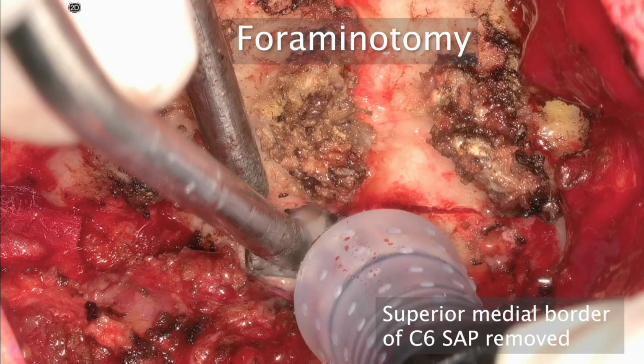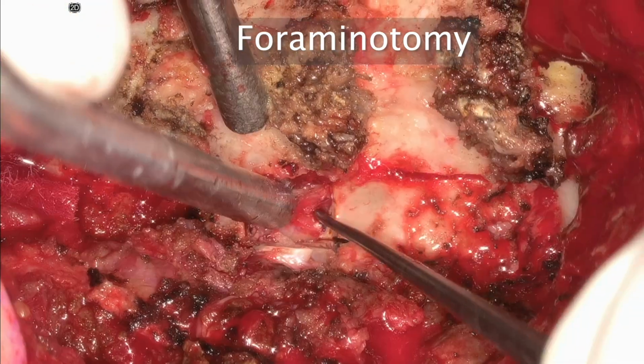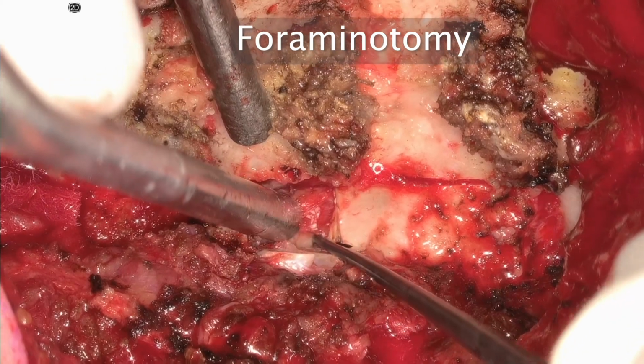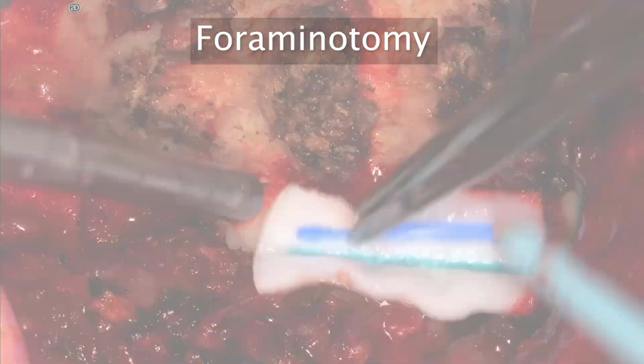So inside the open door, we're also able to perform our foraminotomy. We're taking the medial quadrant of both the IAP, which we do first, and the SAP. So it's an IAP of C5 as well as a SAP of C6.